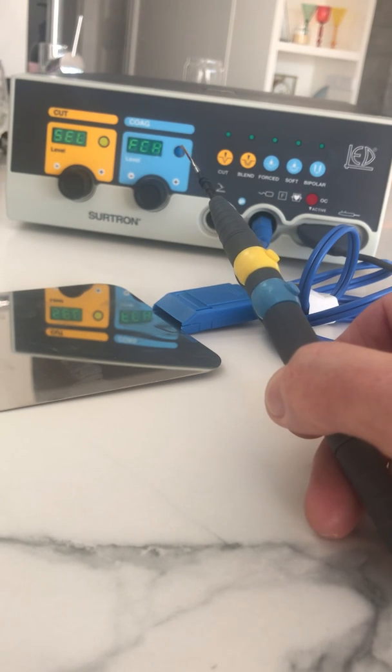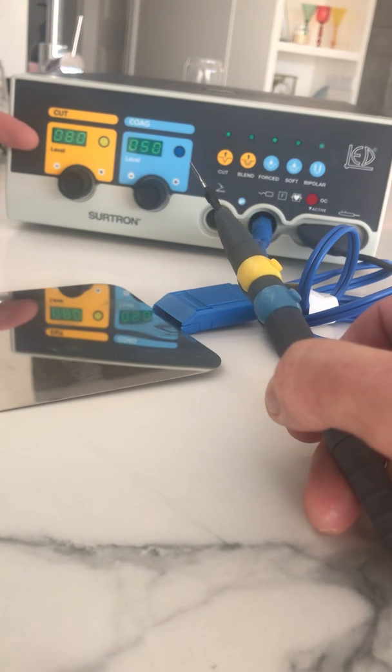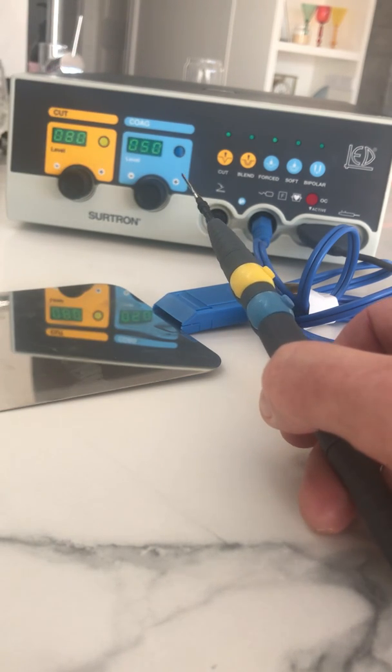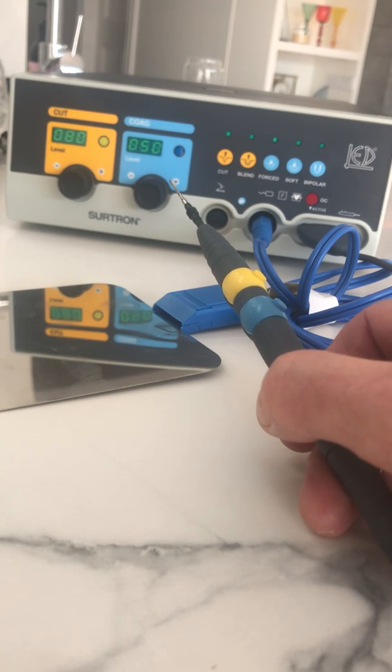Every time you turn it on it has a sound beep letting you know the switch is on. It does a circuit test and comes up as passed. You can see currently I've got the levels set at 80 for cut and 50 for coag, which are the maximum signals. Most people would start around halfway or in the lower quadrant. You'll know if you've got it too high if you're producing smoke or if the tissue is going white — that means the signal is too high. Experts recommend starting as low as possible and gradually turning it up to achieve the signal required.